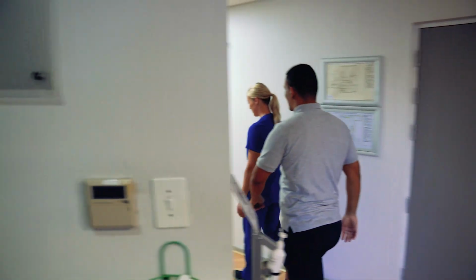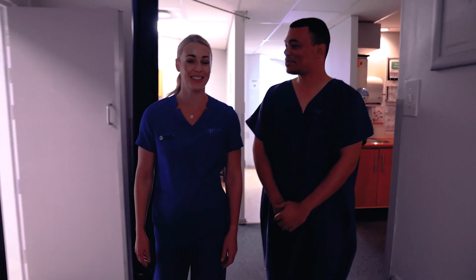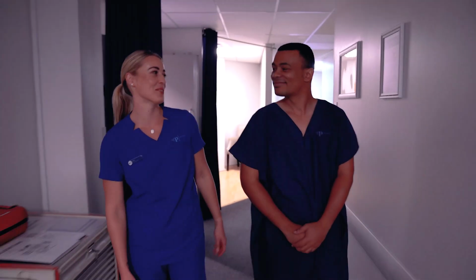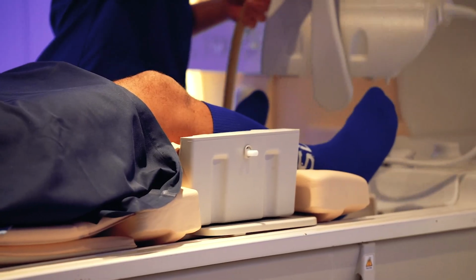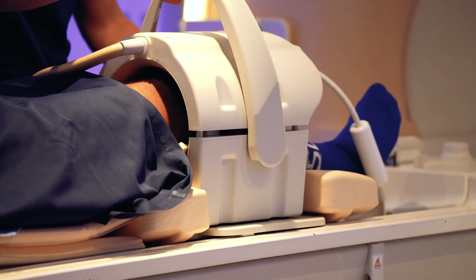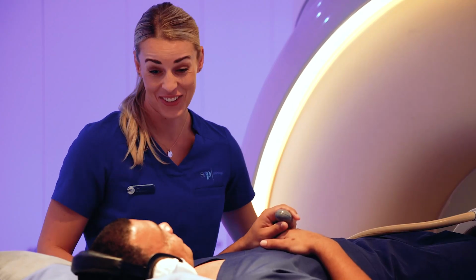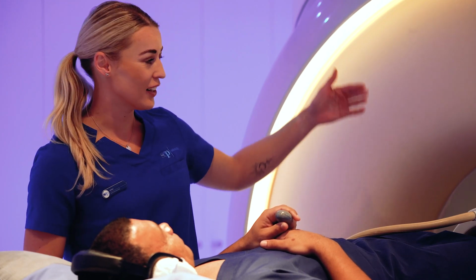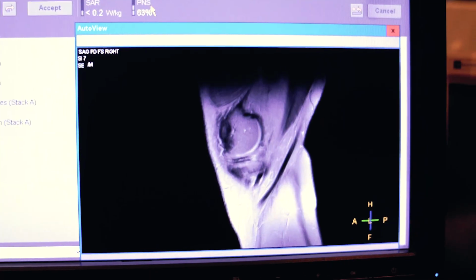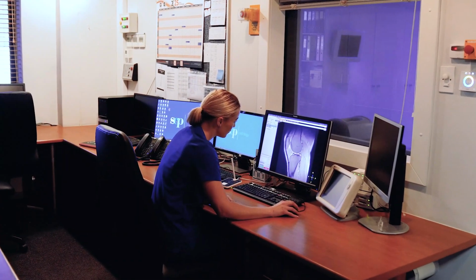And the ligament is like a rope, so it normally looks like a dark band of tissue that joins the femur and the tibia. And we'd look for discontinuity. That's the best sign that there is an injury of the ligament, that it's completely discontinuous, the fibers are not meeting, and there is a fluid-filled gap. Sometimes the ligament sags, so instead of being a tight rope, it actually flops down and is lax. That is also another good sign that the ligament is injured.